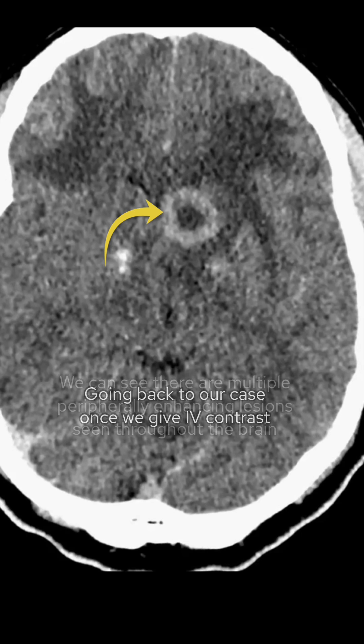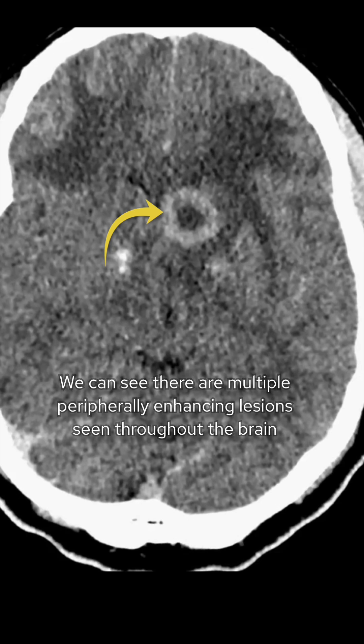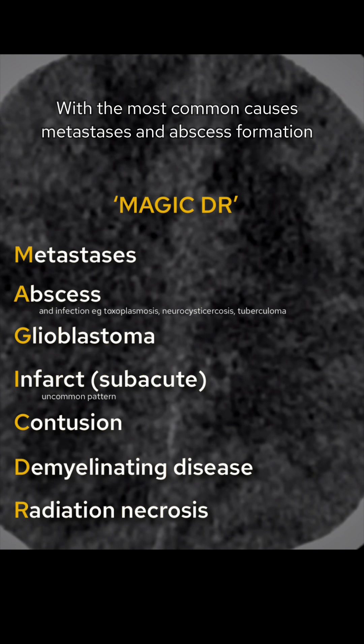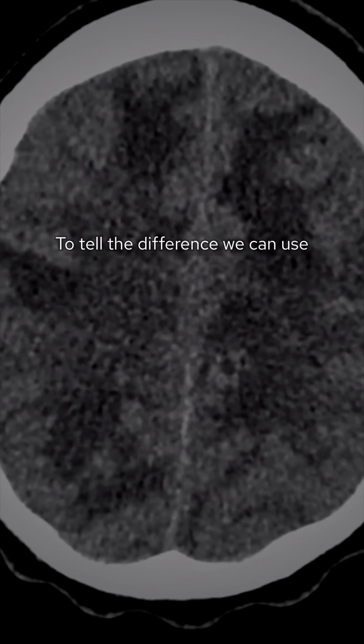once we give IV contrast we can see there are multiple peripherally enhancing lesions seen throughout the brain. Ring enhancing lesions within the brain have a differential, where the most common cause is metastases and abscess formation.